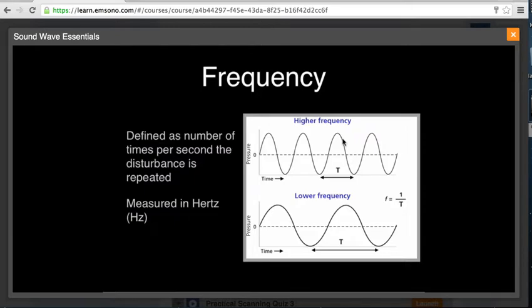because clinically, wavelength is an important factor because it is a factor in spatial resolution. A higher frequency sound wave is going to have a shorter wavelength, and it's going to have the ability to discern between objects that are closer together. Therefore, as the person doing the scanning, you always want to use the highest frequency possible.